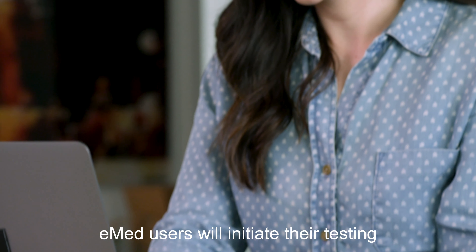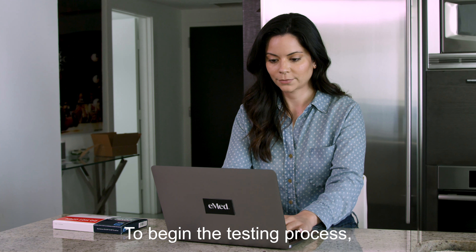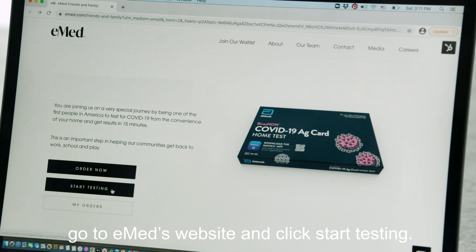eMed users will initiate their testing session through their device. To begin the testing process, go to eMed's website and click Start Testing.